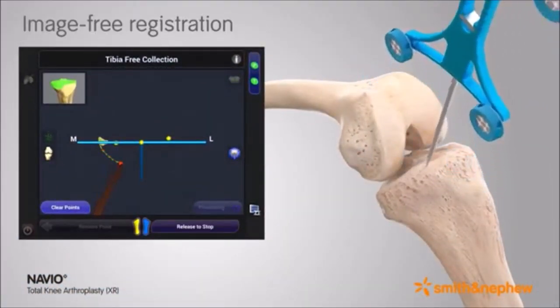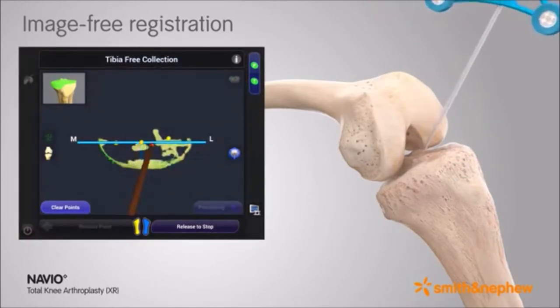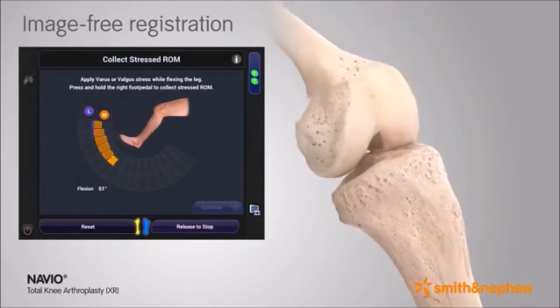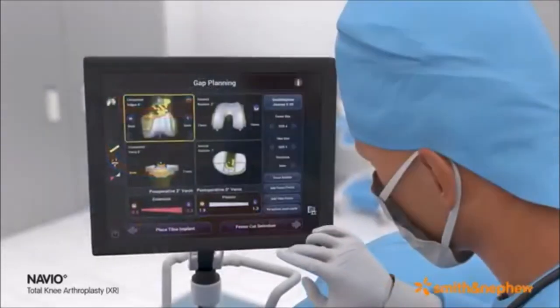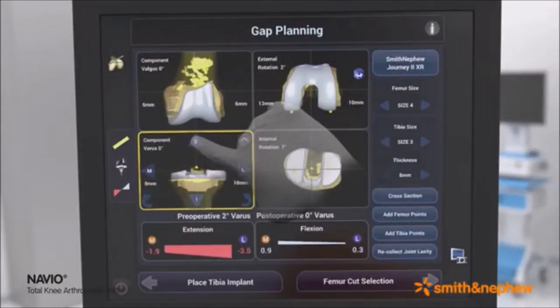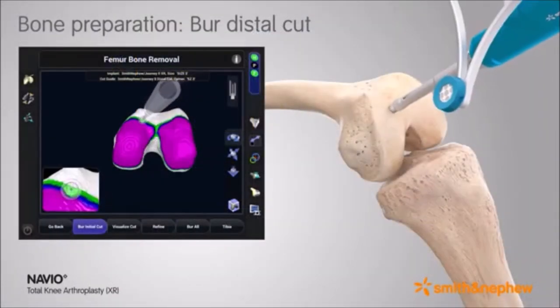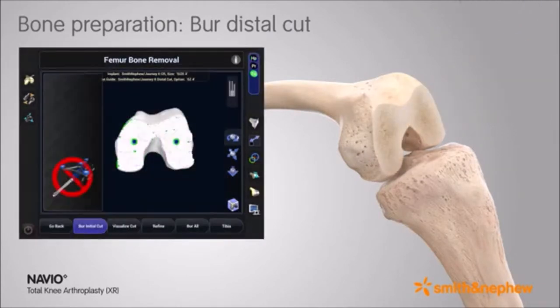First, anatomic landmarks are captured, including a 3D model of the patient's cartilage and bone through direct surface mapping for both the femur and tibia. Next, soft tissue kinematics are evaluated for implant positioning and soft tissue balancing. Furthermore, the surface mapping and soft tissue evaluation provides the surgeon patient-specific planning to virtually place implant components and predict postoperative joint laxity through the full range of motion.